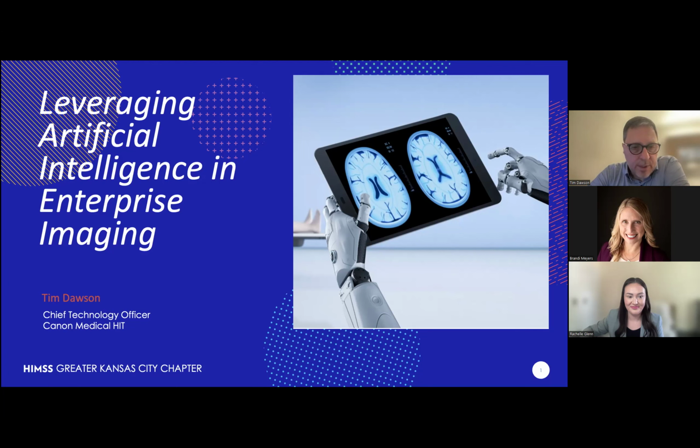Another question was, wouldn't AI be giving false positive results? And wouldn't the radiologist be relying on AI rather than their own instincts? That's a great question. And so, yes, it is possible for AI to give false positive results. The FDA does require that images not bypass the radiologist.